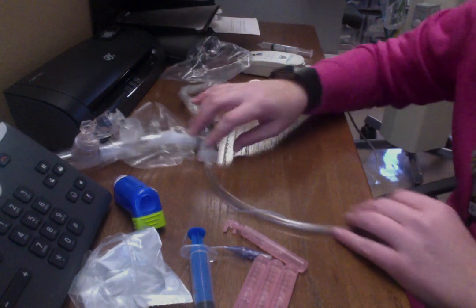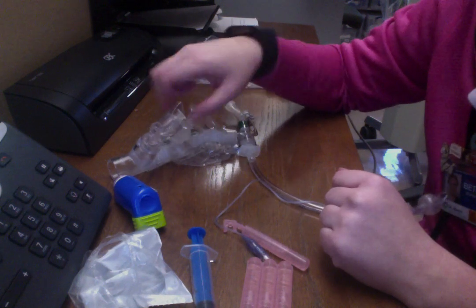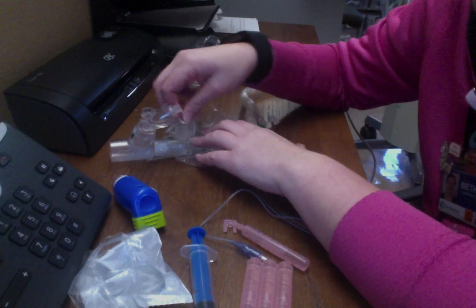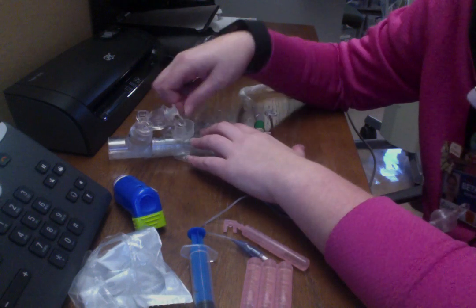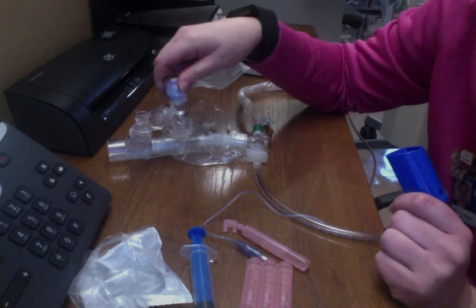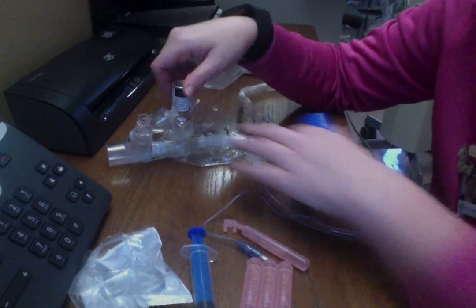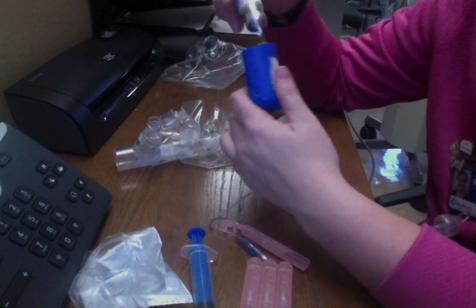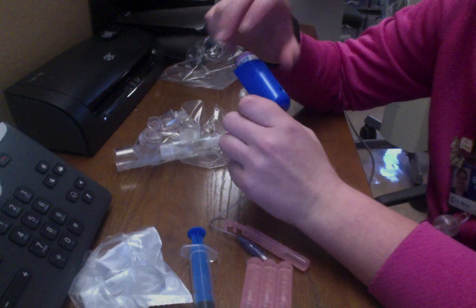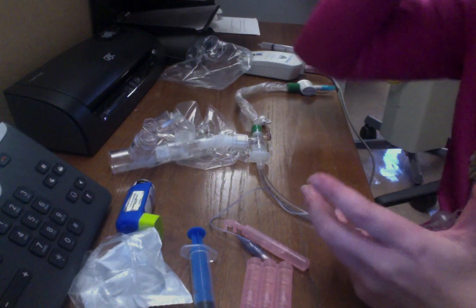The next thing I'll do is my inline MDI. I have a little MDI adapter right here that goes right in line with your vent circuit. You just take the cap off, I have my medication, and you pop this off and it goes right on top here. Then you just push it down for one puff, two puffs, however many puffs you have to give your patient. Stick it back in here so you have your counter going, making sure you're counting how many puffs you're giving so you don't run low.